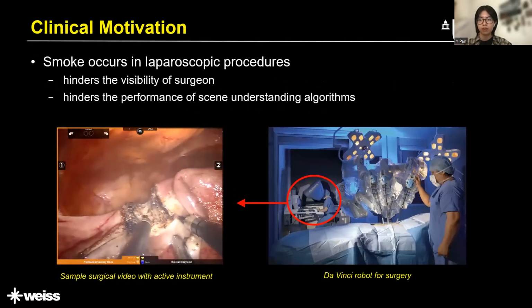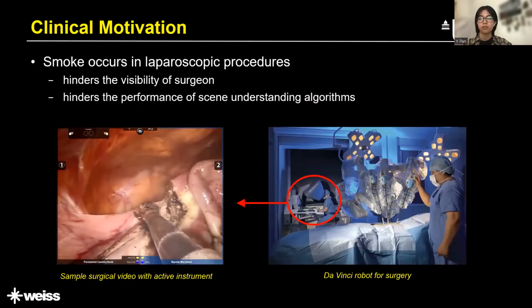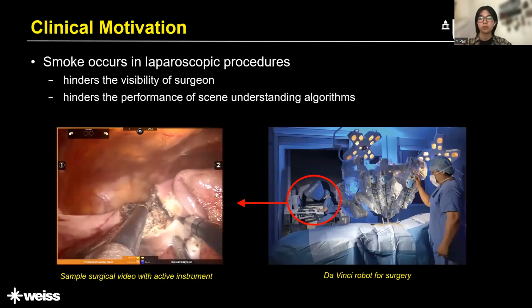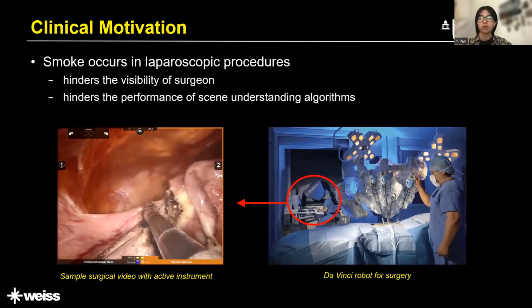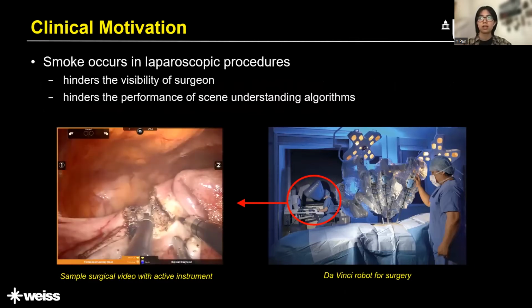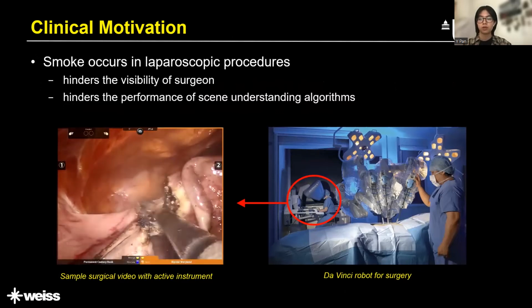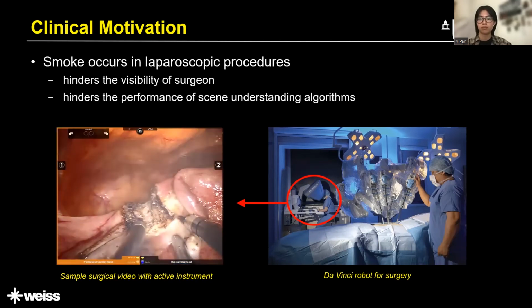Recently, robotic-assisted laparoscopic surgery has become the trend in medicine, thanks to its convenience and lower risk of infection compared to traditional open surgery. However, the visibility during these procedures may be seriously affected by electro-cauterisation, which generates smoke in the operating cavity. This decreases visibility and hinders the procedural time and surgical performance. Recent deep learning-based techniques have shown the potential for smoke removal, but few target laparoscopic videos.